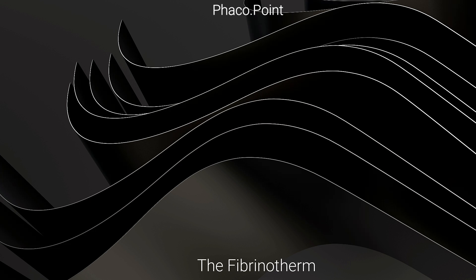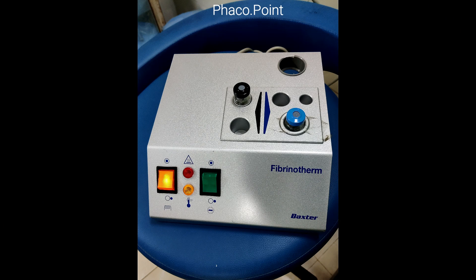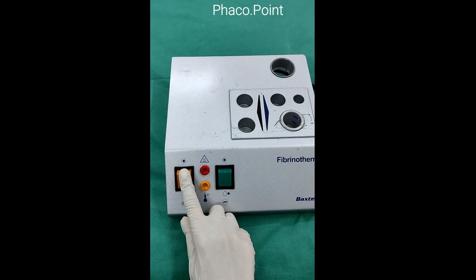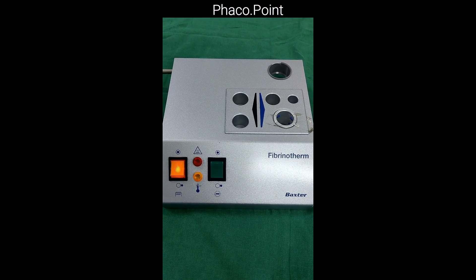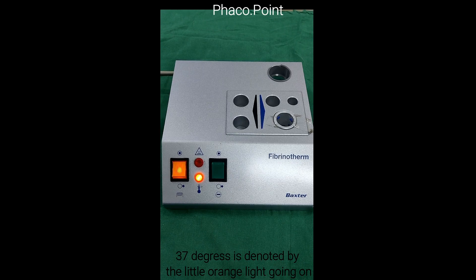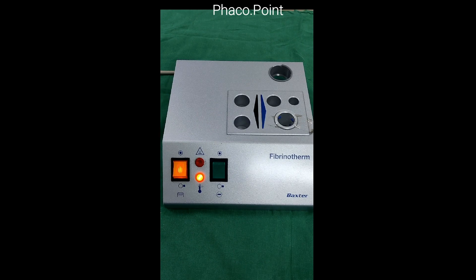The Fibrinotherm is the warming and mixing device. It serves two purposes: to preheat the vials to 37 degrees, and to bring about optimal mixing for perfect reconstitution. The Fibrinotherm has two switches — orange and green. The orange switch is turned on and remains on until it reaches 37 degrees, at which point a small orange light comes on intermittently to maintain that temperature. It generally takes two to five minutes to achieve 37 degrees.